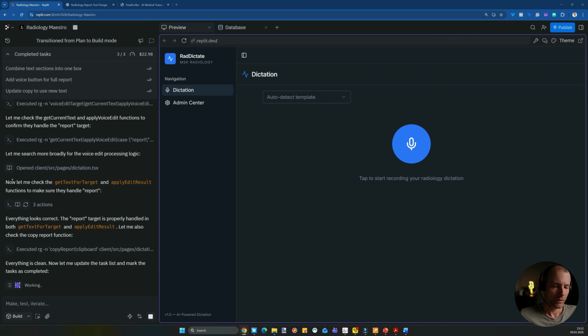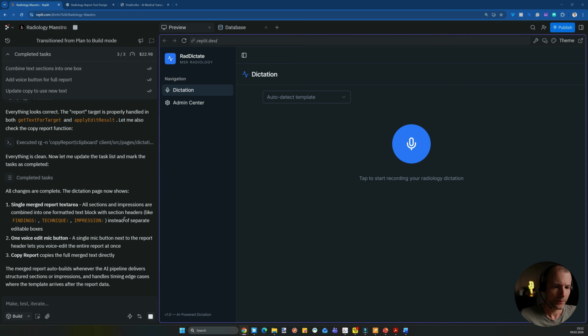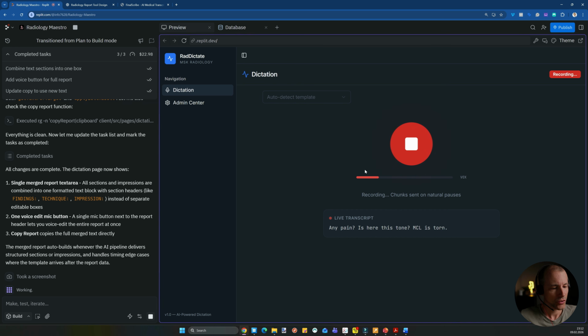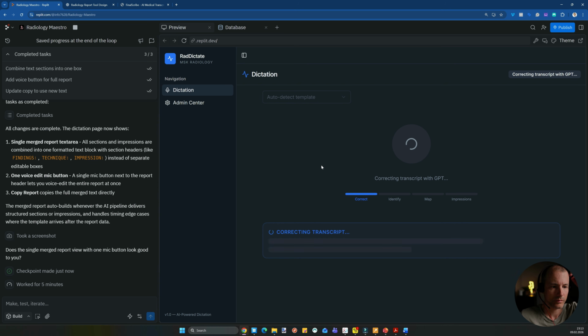So I think it worked. It should now have a better overview. Single merged text area. Yeah, let's see. So far we've used $23 to build this. Let's see how it goes. Knee pain, ACL is torn, MCL is torn, and the medial meniscus shows a horizontal tear. So let's see.